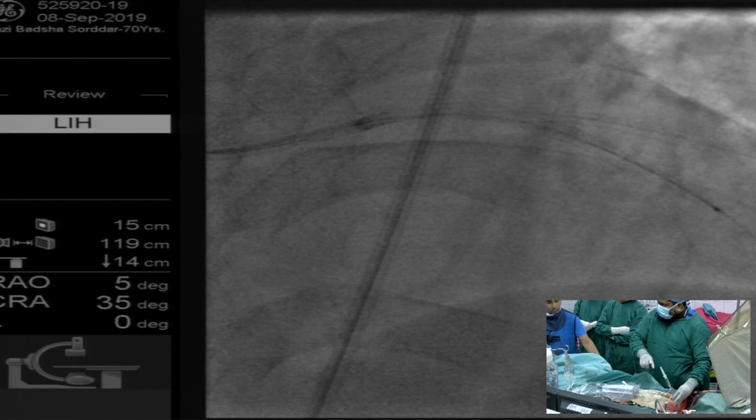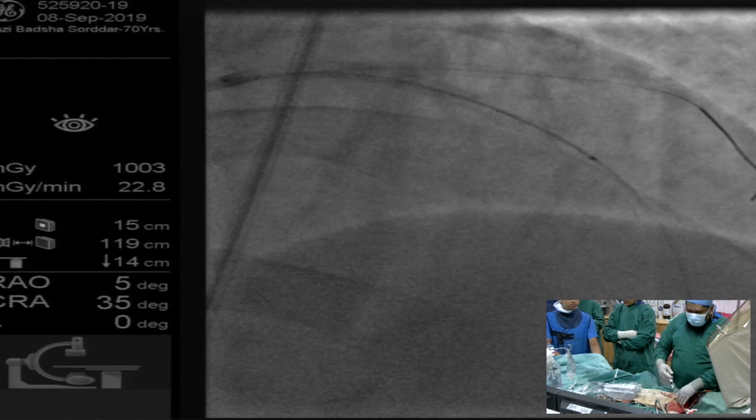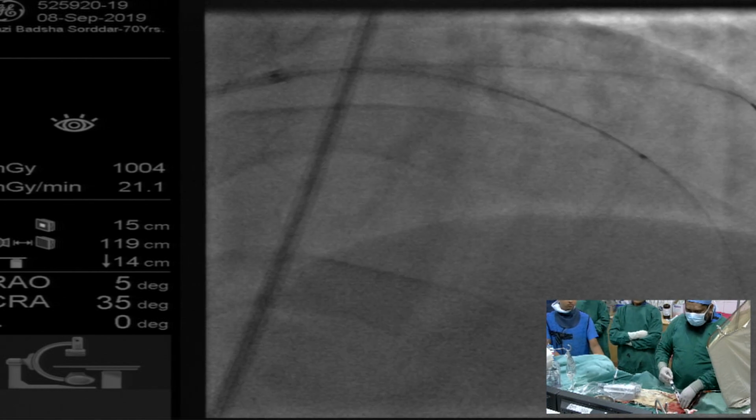GTN, nitro. I already gave, and the pressure is a bit low. But can you do it with this syringe? It's more of a suction syringe. Will it go? We're using a suction syringe to give. Yeah, yeah, 16. Don't give the whole thing, na? Okay, wonderful. Yeah, don't have to push that hard, right? You have to push hard? Yes, it is.